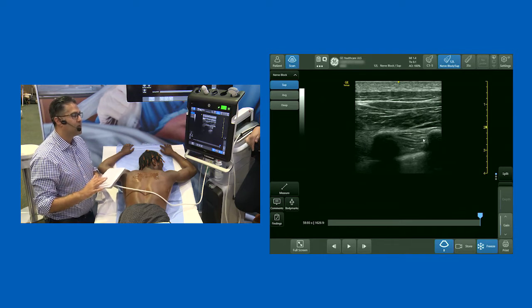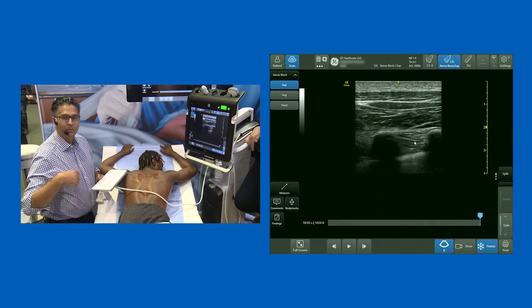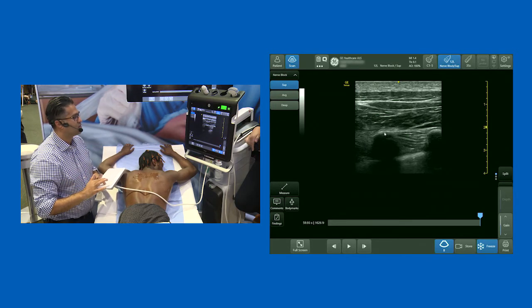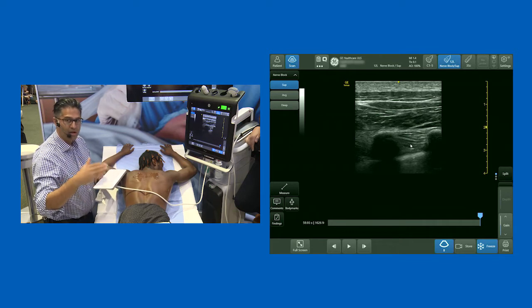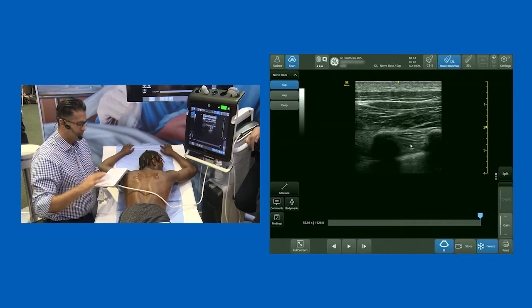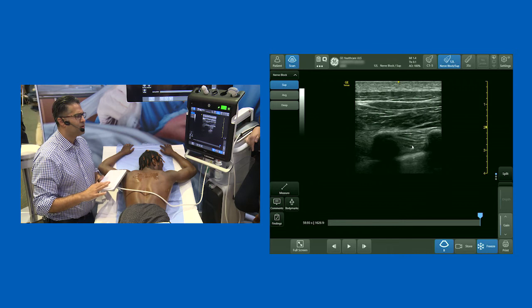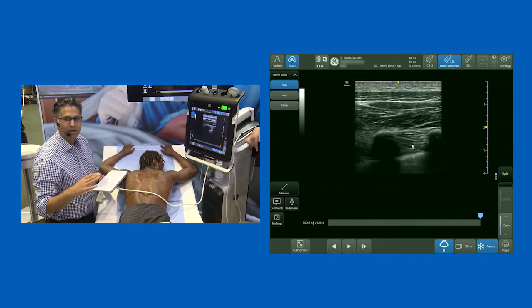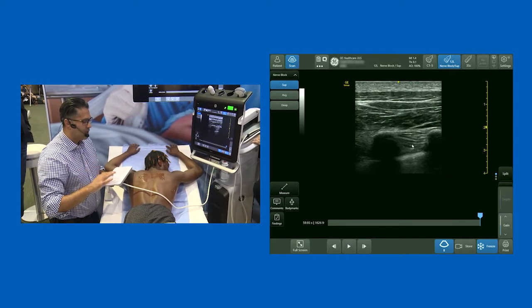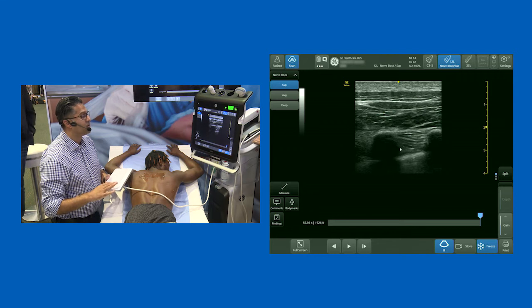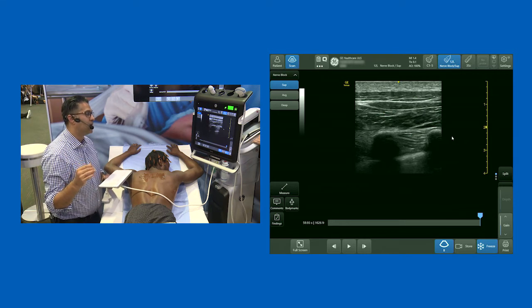What we noticed — and this is why paravertebral by-proxy techniques may have a role — is that sometimes you can be above the costo-transverse ligament at the MTP point. Iwana Kostash and colleagues described this technique: your local anesthetic is clearly away from the pleura, making it a safer technique. You inject local anesthetic and the pleura drops. We've traditionally thought the costo-transverse ligament was an impenetrable barrier, but that's not the case — there are holes in it; it's not a solid sheet and doesn't cause complete obstruction.